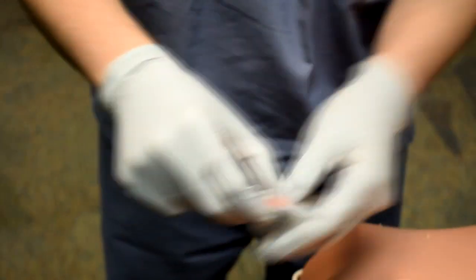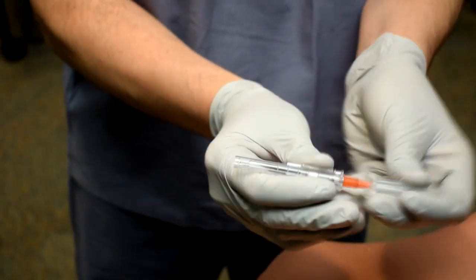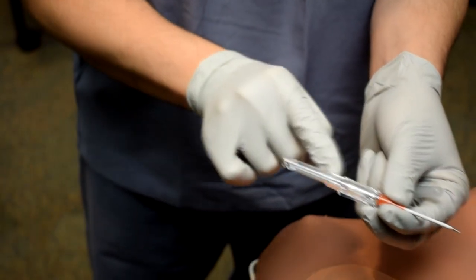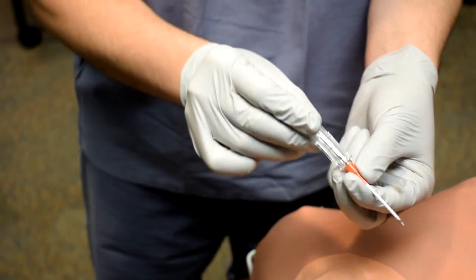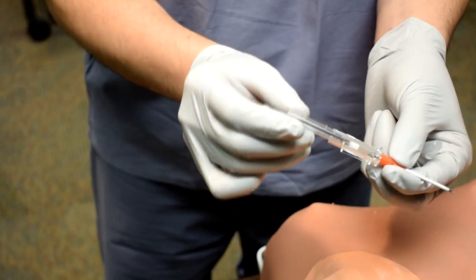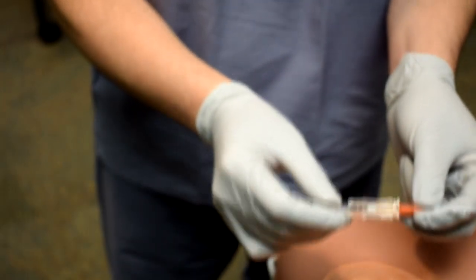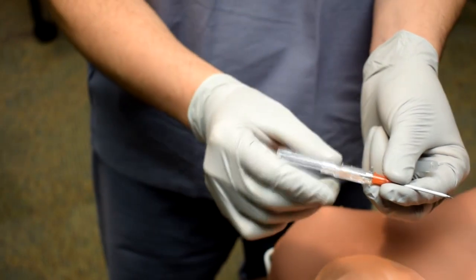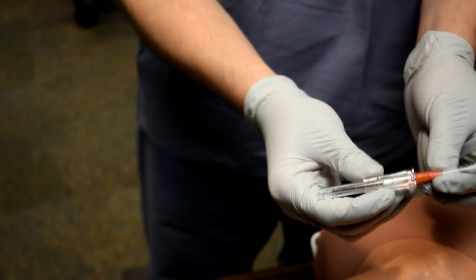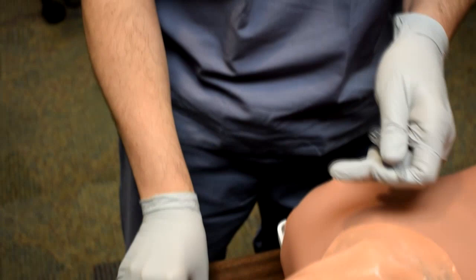The other angiocaths that people might see are these IVs that are protective. On this, there is a needle and an angiocath, but it has this protective component. And this would be where if you were getting IV access, you would slide this forward. But what you can notice is there's nowhere to put a syringe on this. So if this is all that you have, you can use this, but know that you can't attach a syringe, so you won't get the feedback of seeing air enter the syringe. But in an emergency, you can use the protective IV without a syringe if needed.